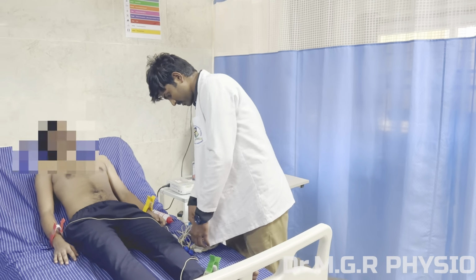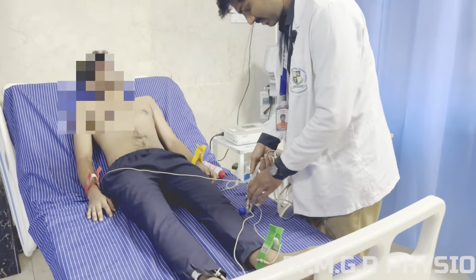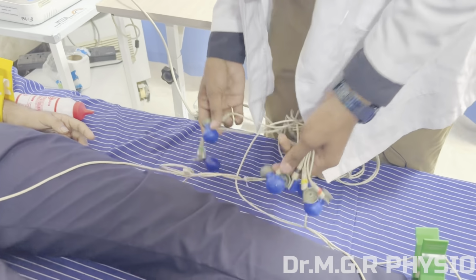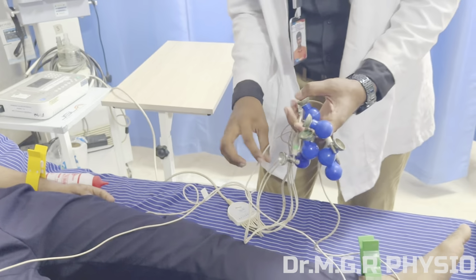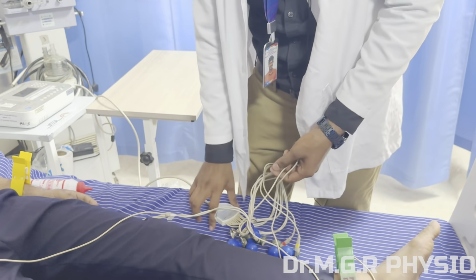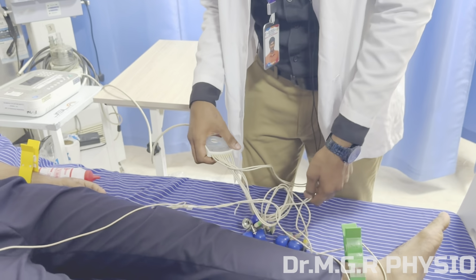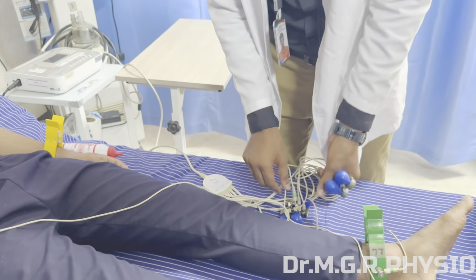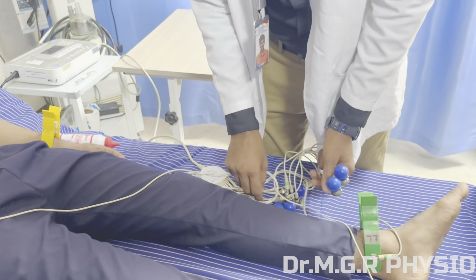Okay. Then we move on to the chest leads. As I said earlier, we have two systems, the AHA and the IEC settings. In the AHA setting, you have V1, V2, V3, which indicate precordial leads. Whereas in the IEC, that is this system, we have C1, C2, C3, which are the chest leads basically.